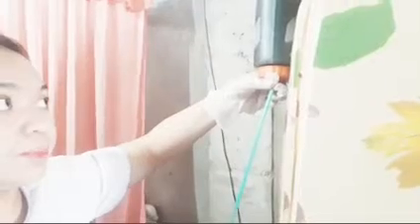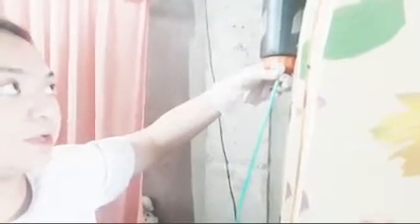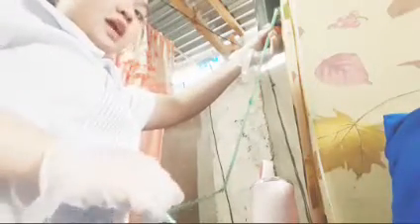So I will now remove the tube. I will now remove the tube from the IV solution bag. Now, I will remove the tubing from the container and straighten it out. Also, close the roller clamp. Finally, removing the tube from the former IV solution bag, which is already empty, the fluid is all gone.